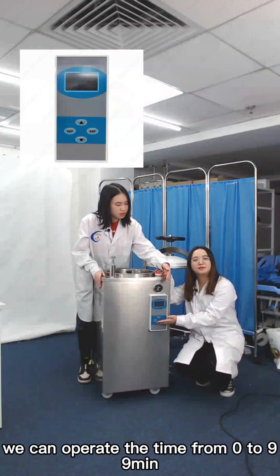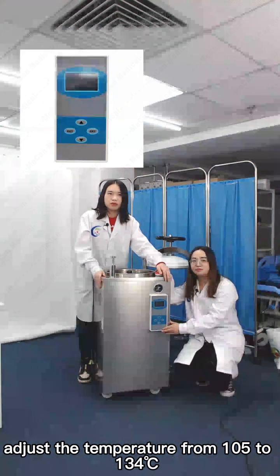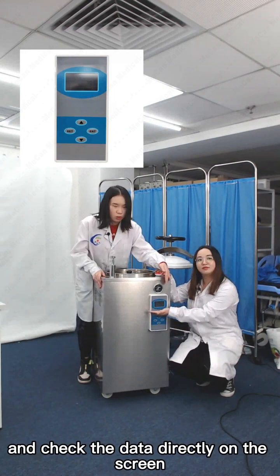We can operate the time from 0 to 99 minutes, adjust the temperature from 105 to 134 degrees Celsius, and check the data directly on the screen.